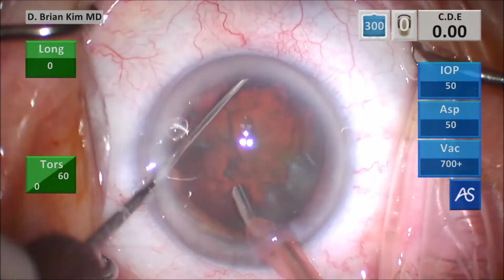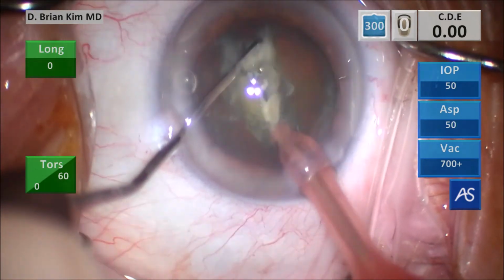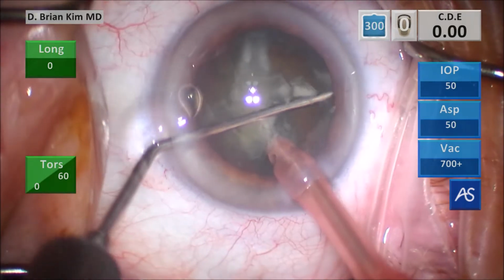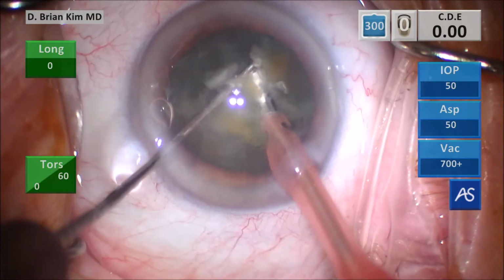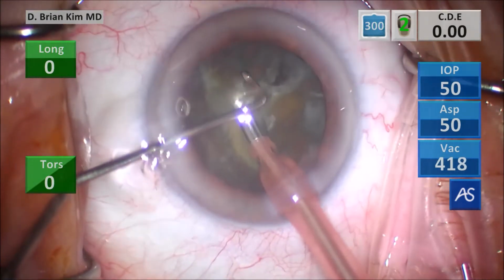Place the chopper under the rhexis edge contra-incisionally. Place the phaco tip vertically sub-incisionally, bringing both instruments together, slowly crushing the lens completely in half, separating it, making sure it separates, placing the chopper around the right heminucleus, pulling it centrally towards the phaco tip, dividing the right heminucleus and making sure they're all separated. That is double chop and cross chop.